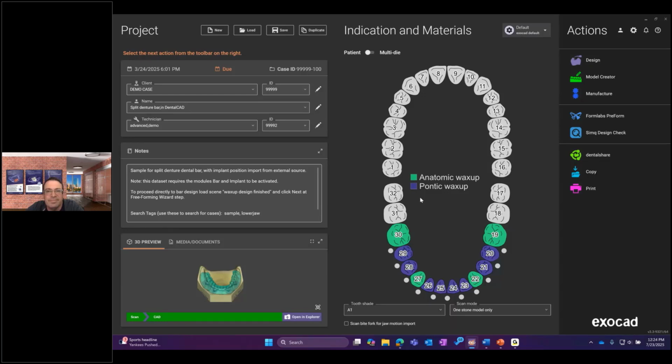So, as of right now, you'll just have to either download the new libraries from the website and install them manually into the public prototype installation, or if you had recently downloaded them on 3.2, you could potentially copy those from that folder. But as always, just don't copy the whole library folder from one version to the next. There's some files in there that really control functionality. So, yeah, that's a good point. We didn't get rid of Library Manager. It's coming back. It just didn't quite make it in the release process here.